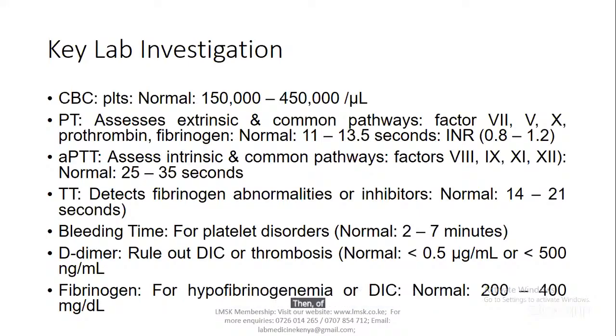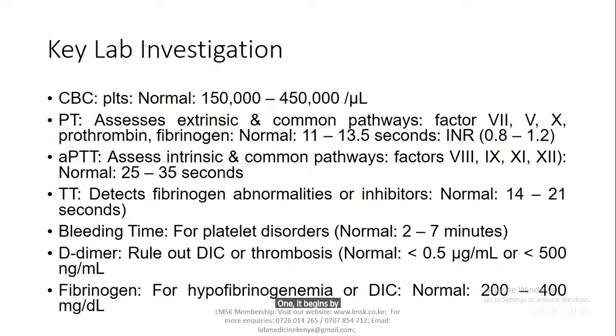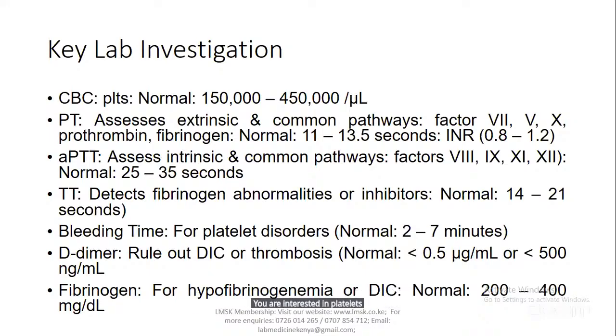Then, of course, you can also do the physical examination, which I've explained there. Easy bruising, petechiae on the skin, ecchymosis on the skin, bleeding on the mucosal membranes, and the rest. And then we, as the lab scientists, also have a role in the investigation of these abnormalities. One, it begins by complete blood count. And what do you look at in complete blood counts? You are interested in platelets, which have a role in hemostasis.